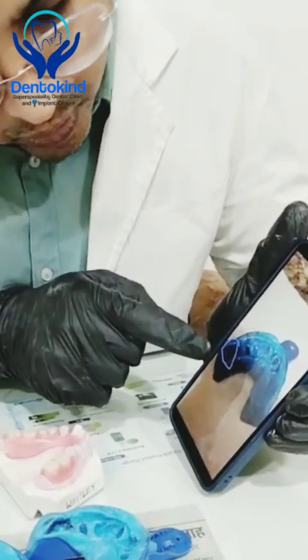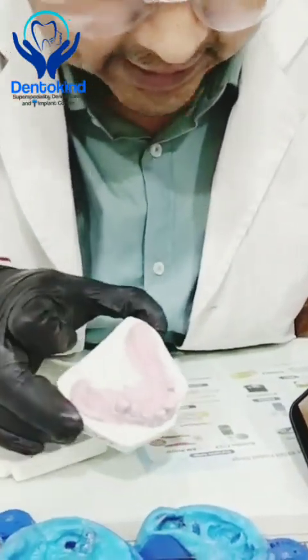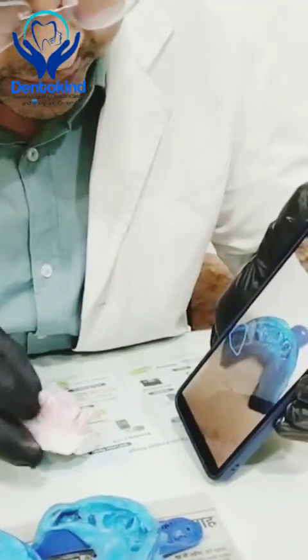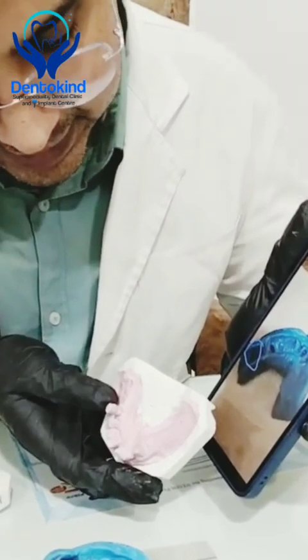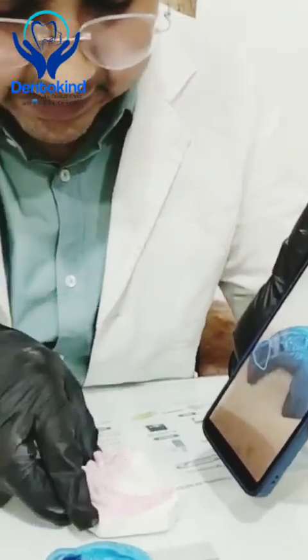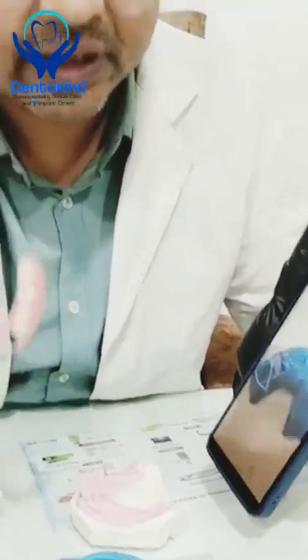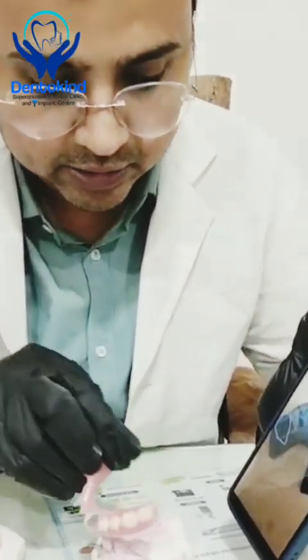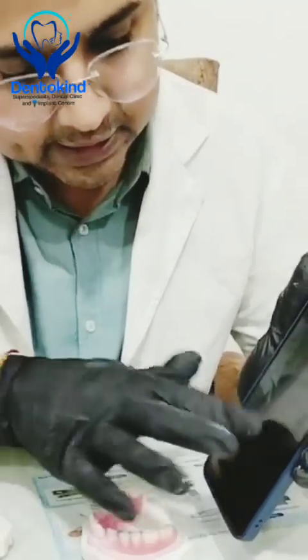They wanted to omit this tooth — and you can see we have omitted it. We have omitted these teeth from the impression and made these dentures. Now they have two teeth with dentures, so this would serve as an immediate denture. Just after the extraction, they will be able to wear these teeth right away.